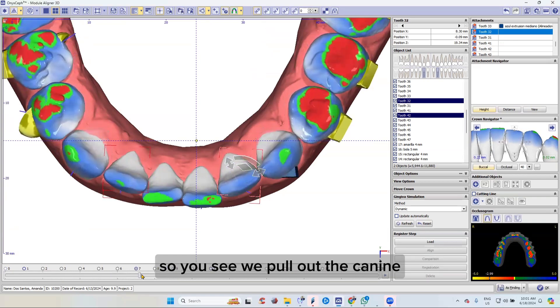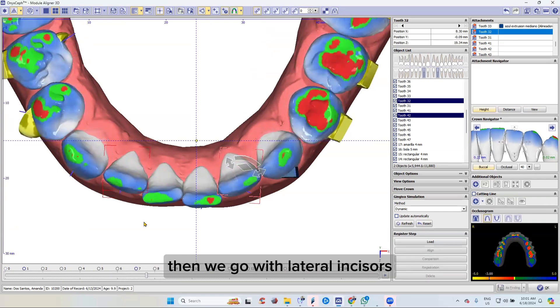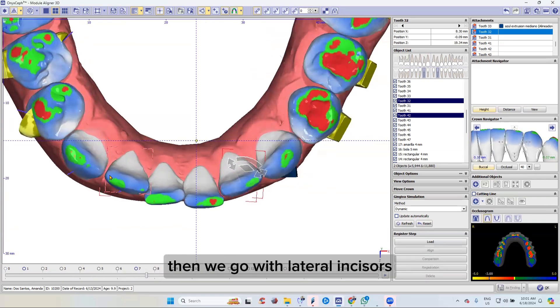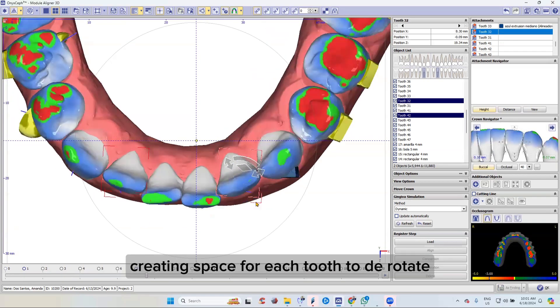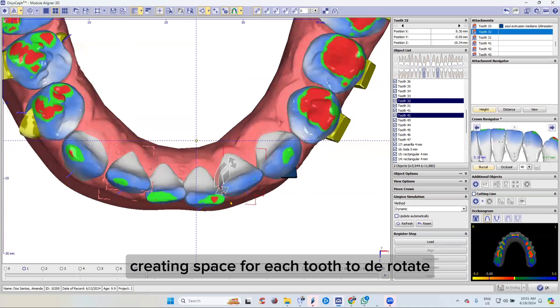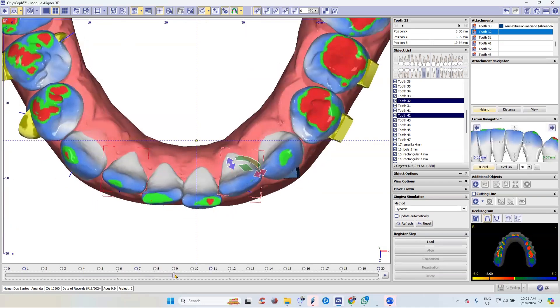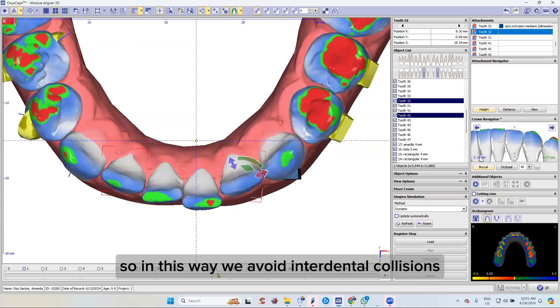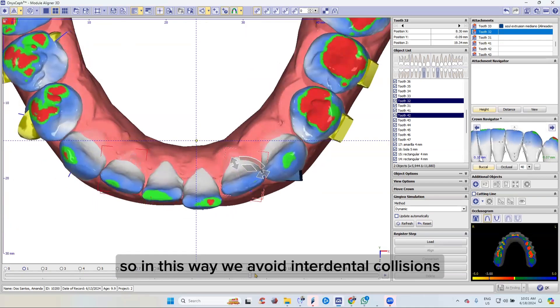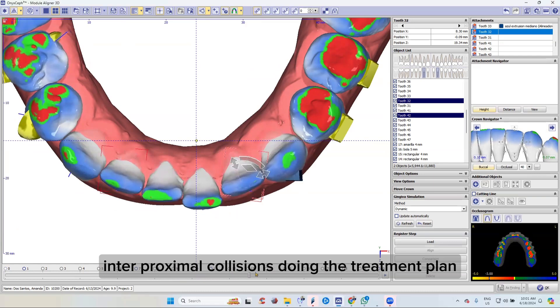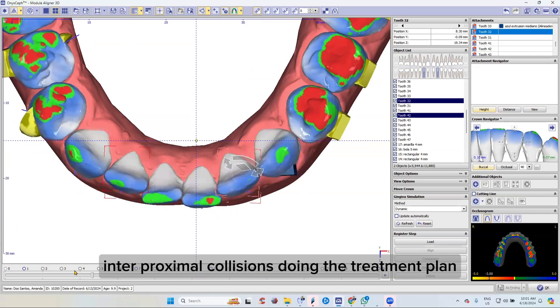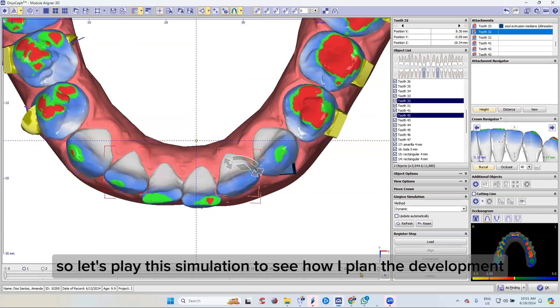So you see, we pull out the canines, then we go with the lateral incisors, creating space for each tooth to derotate. In this way, we avoid interdental and interproximal collisions during the treatment plan.